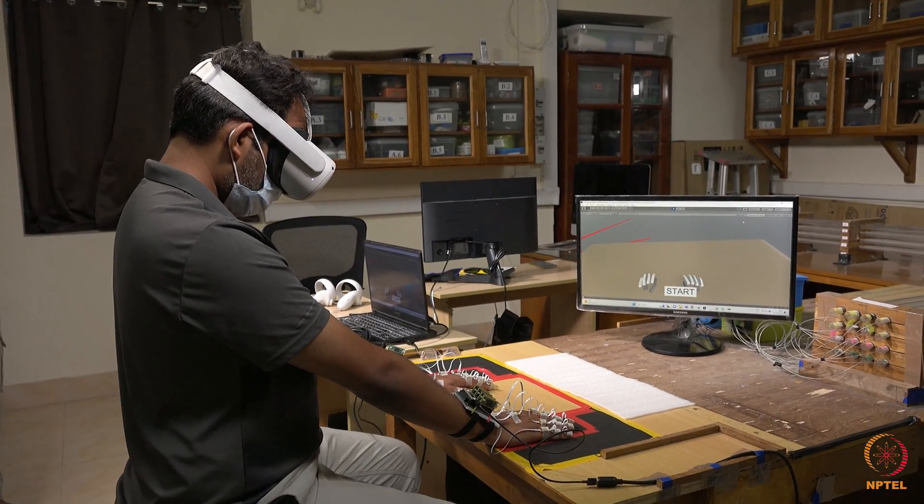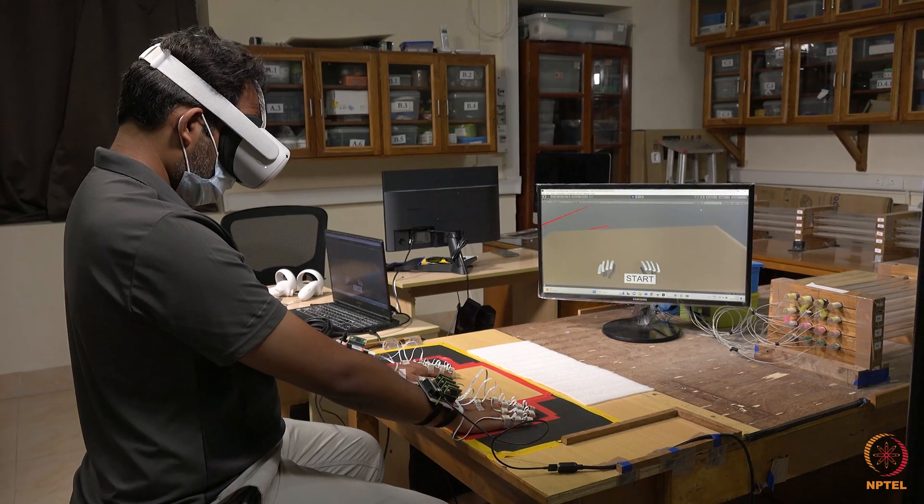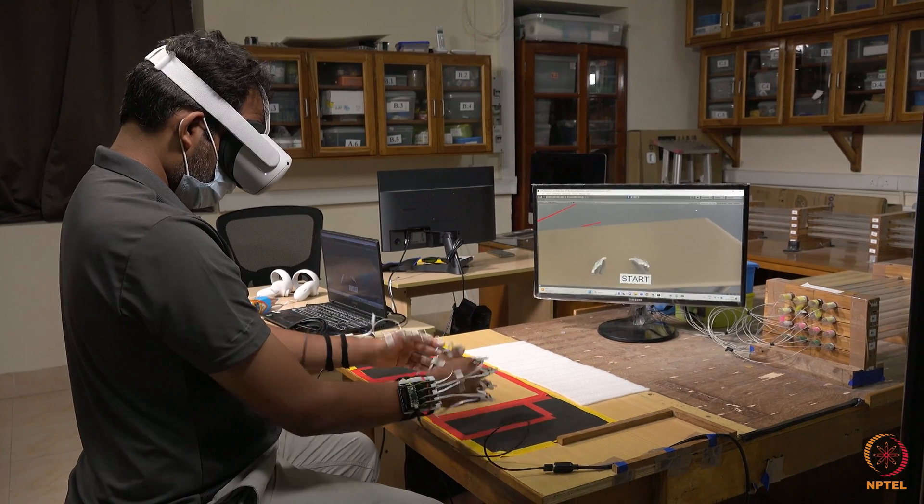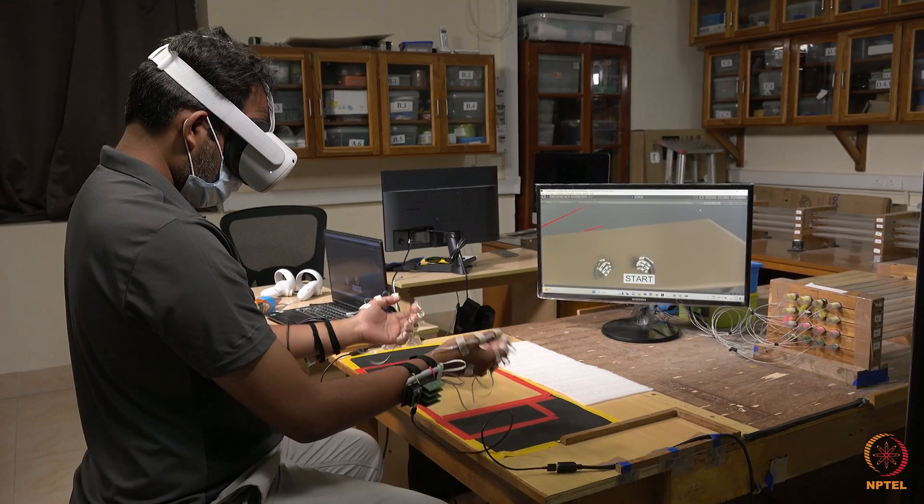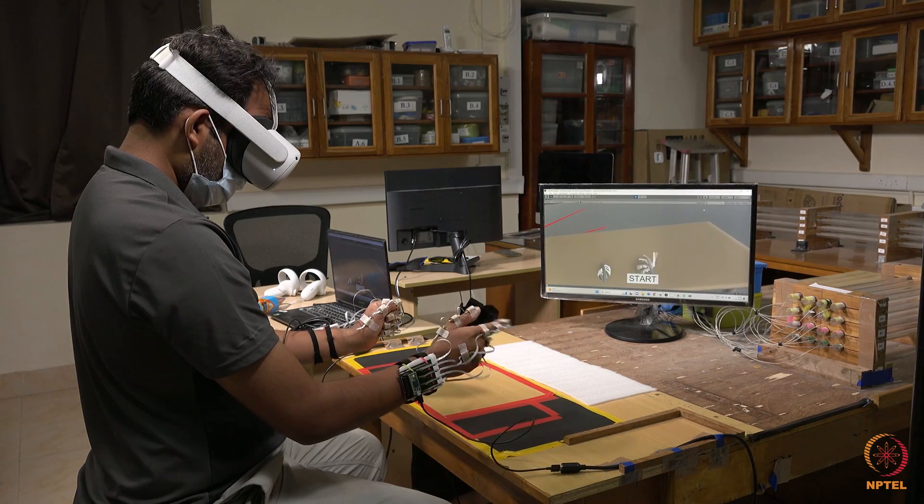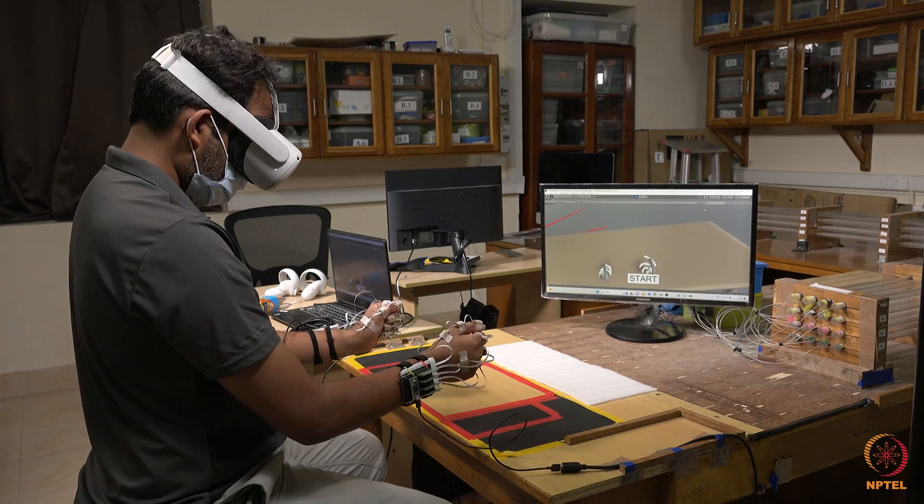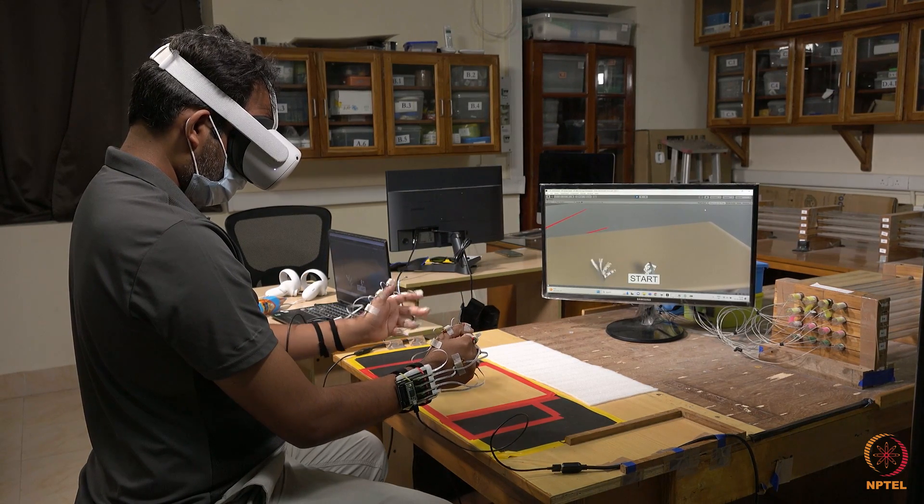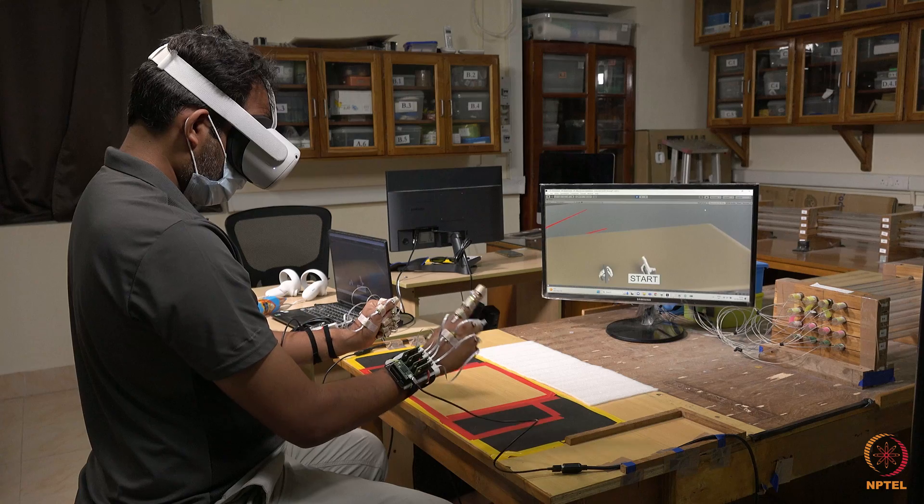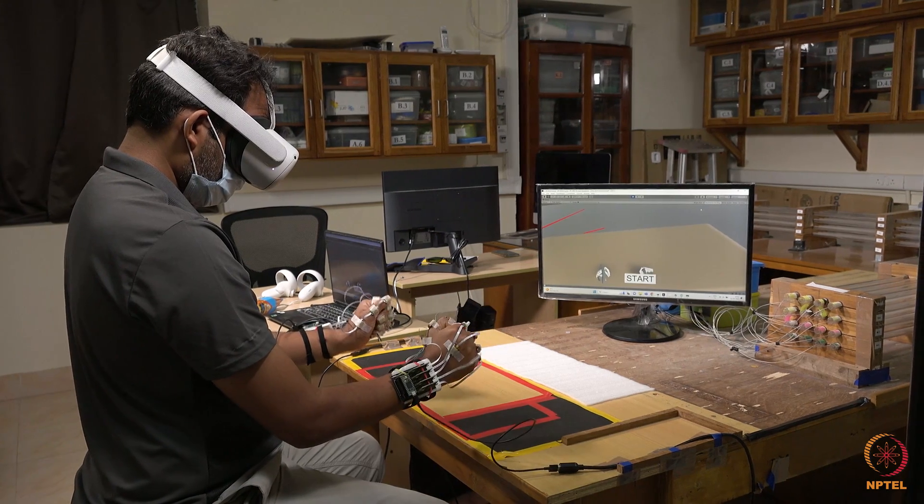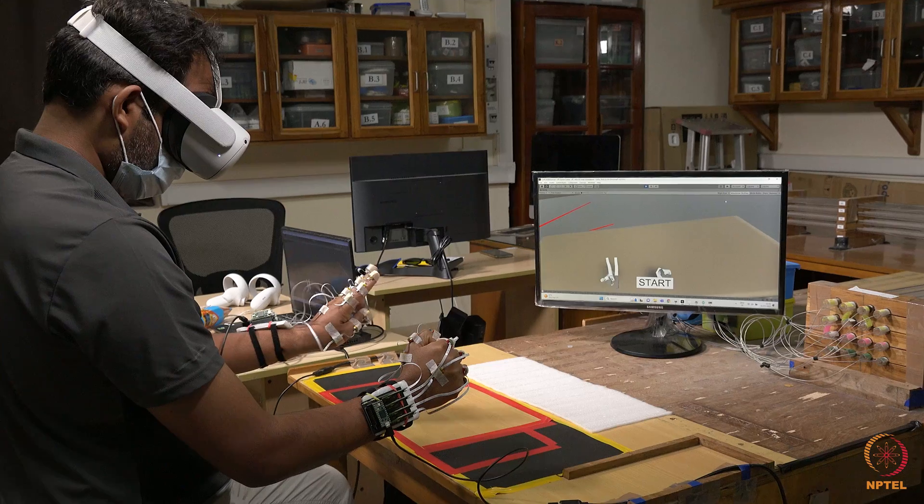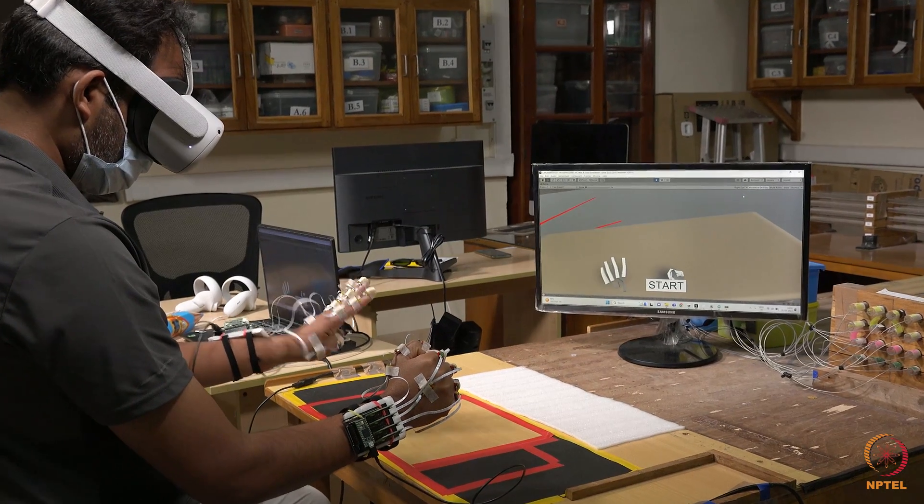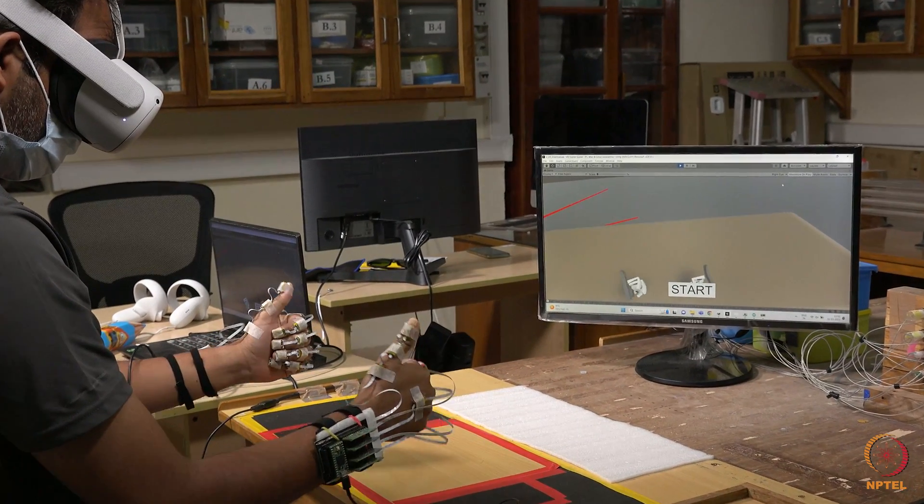This is a VR based application which is developed using the Unity game engine software. This application accepts kinematic data from two HKMS devices and uses it to animate a pair of virtual hands in VR space. The animation of the virtual hands is done using raw quaternion data.